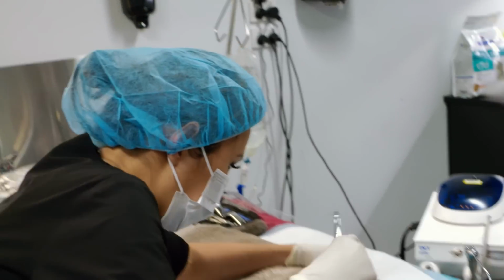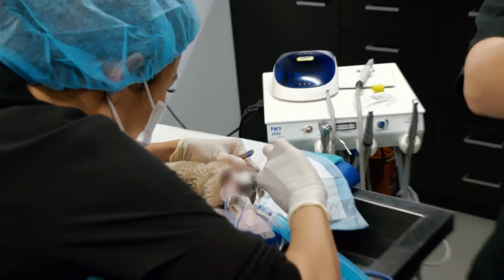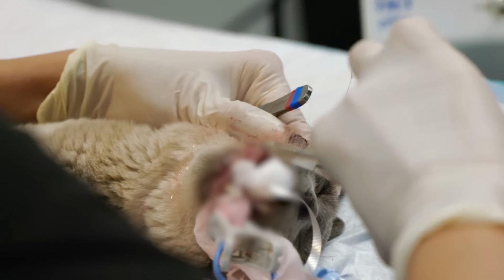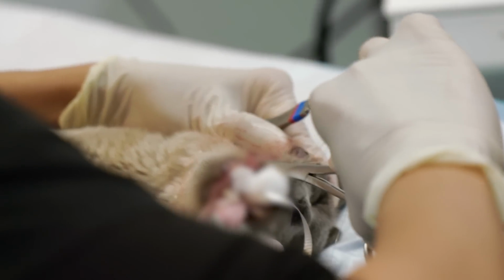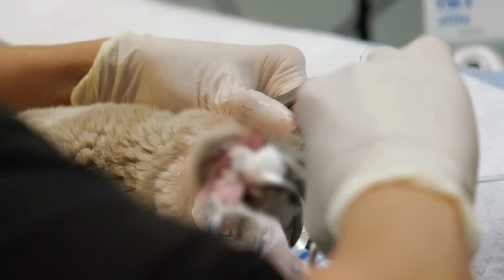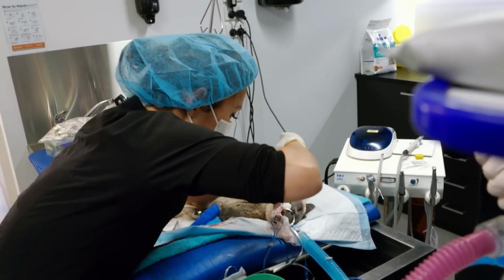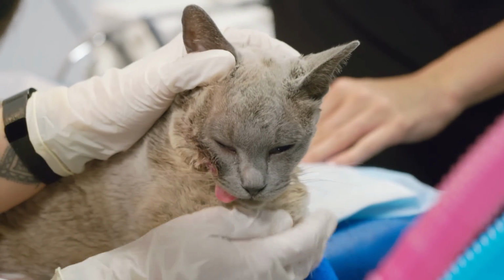All right, we're going to suture up this big hole where I took the tooth out of. We've given it a really good flush with saline to get all that pus and infection out. Once we've done this, we're going to clean up all the rest of her teeth and wake her up and send her home. I'm really looking forward to taking Misha home to Priscilla. I know that she's waiting anxiously for her. I'm also really excited to tell her that we managed to get rid of the problem and how we're going to move forward to make sure that this doesn't happen again.